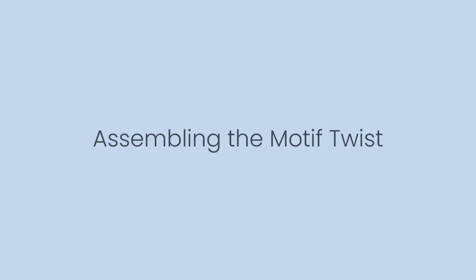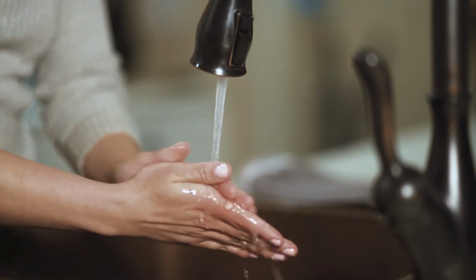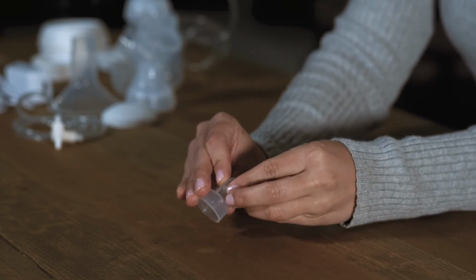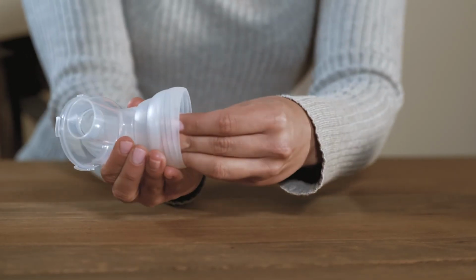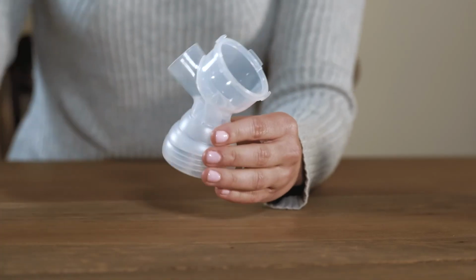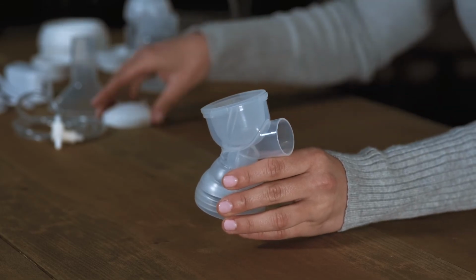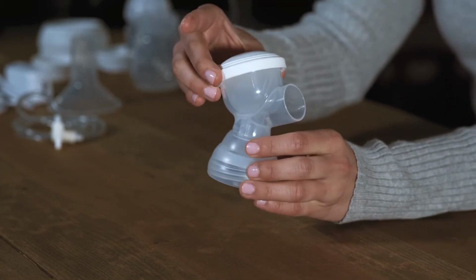Assembling the Motif Twist. Prior to each assembly and pumping session, be sure to wash your hands before touching any breast pump components. With clean hands, snap the membrane into the valve until it lies completely flat. Place the valve up into the connector and make sure the seal is tight. Next, attach the diaphragm on top of the connector. Connect the diaphragm top by attaching it to the top of the diaphragm.